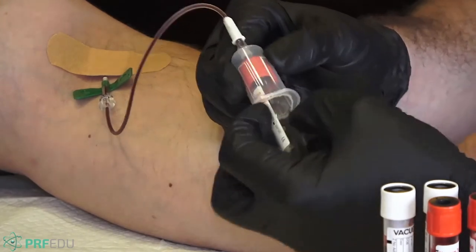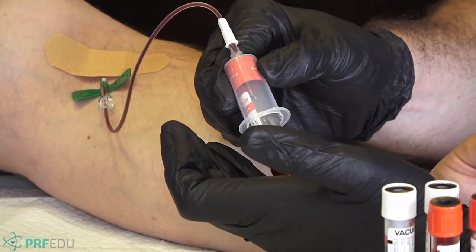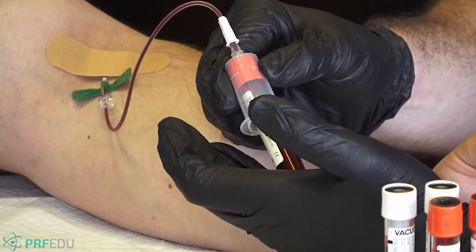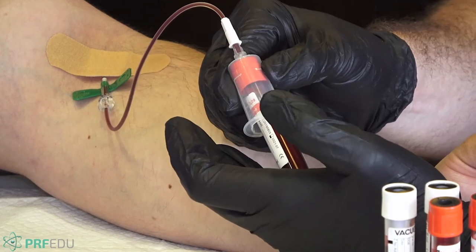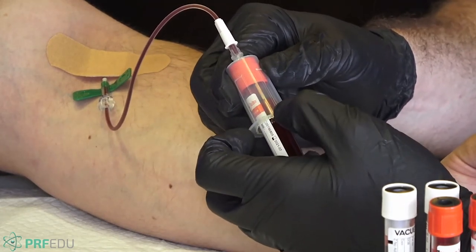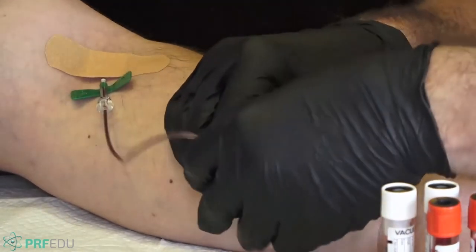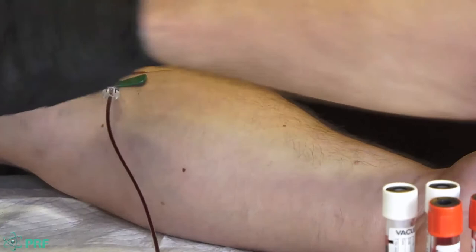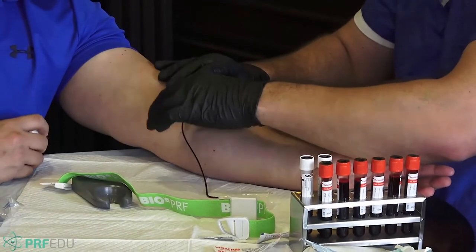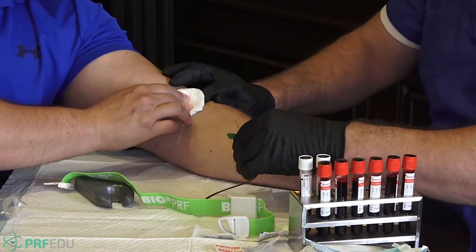All right, we're on the last one. Carlos has been an excellent patient. We're sitting there quietly. Perfect. Okay, when we're done, of course, we already have the machines that are set up, open, ready, on the right protocols. Okay, on this last tube here, I can tell Carlos to open up his fist. Perfect, so that we're going to decrease the pressure. Of course, we have to take off the tourniquet, okay? And then we wait a few seconds here, and then what we do is we pull this out and push down. So this comes out and then down, and then you ask the patient, can you hold that?